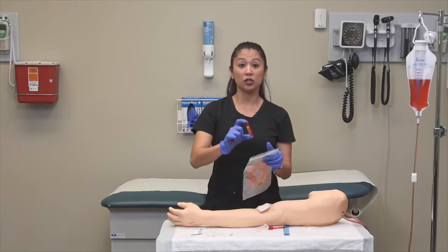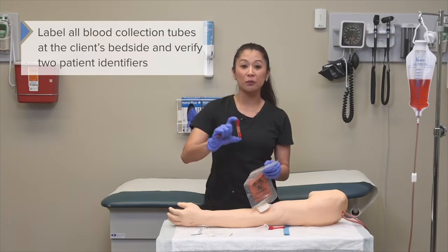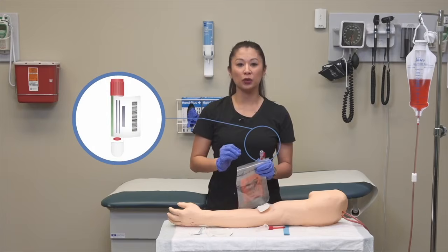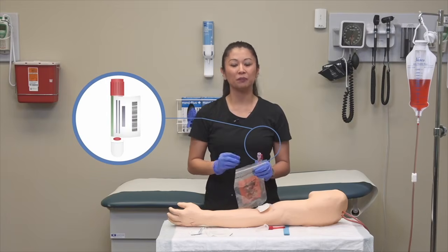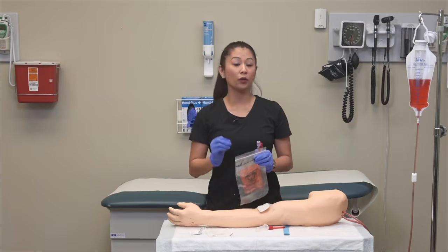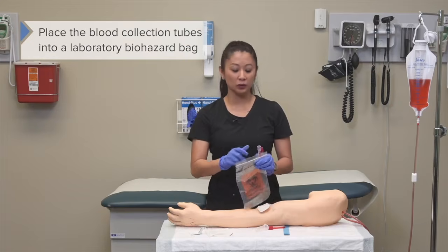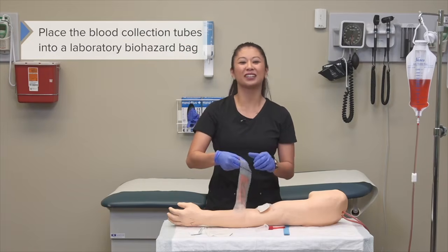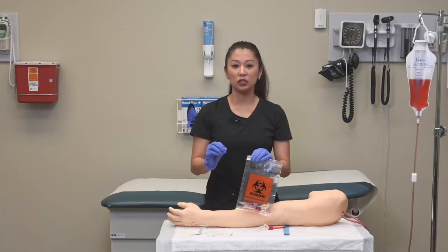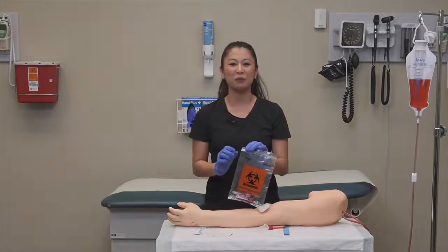Now it's also important to note that once we invert it and we're ready, you've got to make sure that you label the blood collection tubes. Now you want to do this at the client's bedside to make sure you get the right patient and the right date of birth. Also know that sometimes you can get this label from the electronic medical record or the patient label, so make sure you follow your agency's policy. Now once we're labeled, we can go ahead and place our blood collection tubes into the laboratory bag. And it's also important to note that all specimens that have any sort of blood or body fluids need to go into this type of bag.